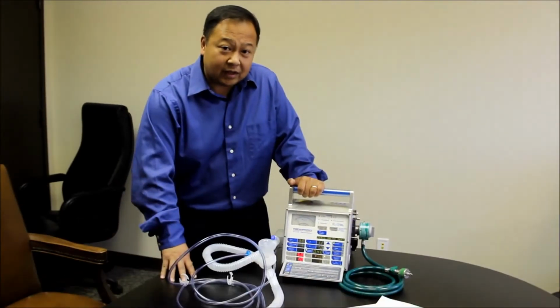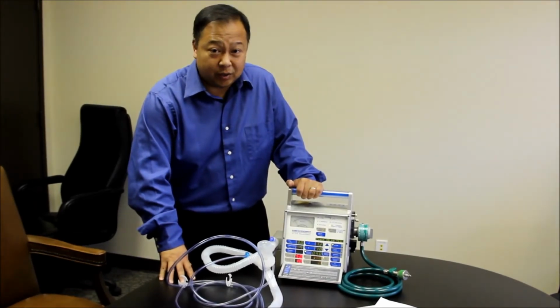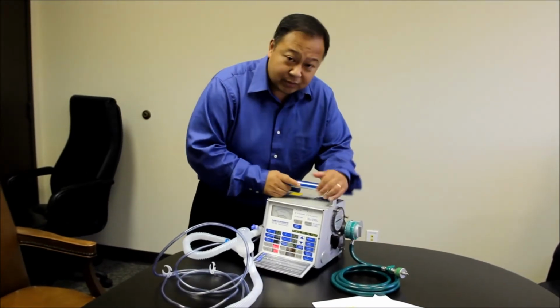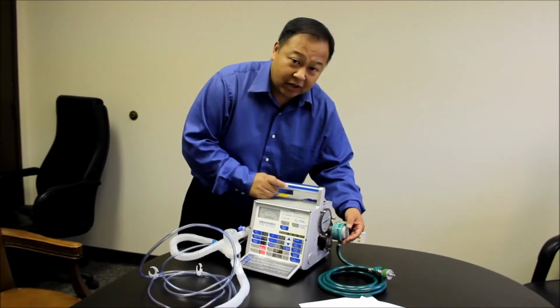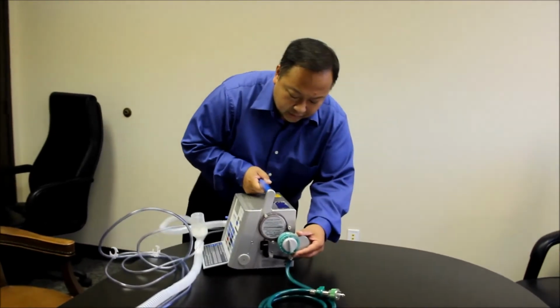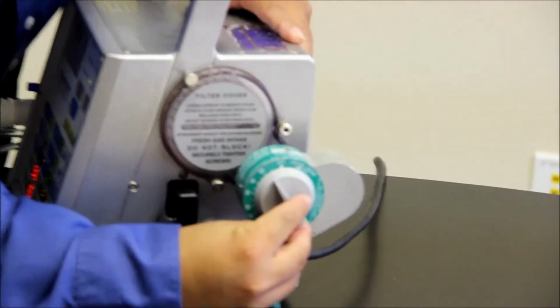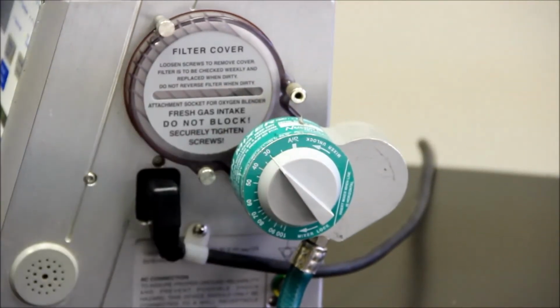Okay. And the other thing that I'd like to show you is the oxygen. Say for instance, I needed to put a patient on 30% FiO2. Every ventilator will have an oxygen button control. For this particular ventilator it is on the side. This is a blender that we use to provide the oxygen. So if you can see here, it's being calibrated by percentage. So if I want 30%, I'll just put it on 30, and that will give me the 30% of FiO2 that I would need to deliver to our patients. And so this will be providing the oxygen for our patients.